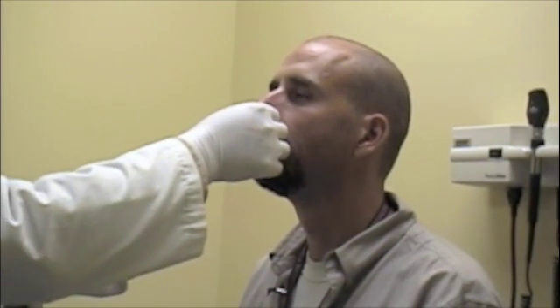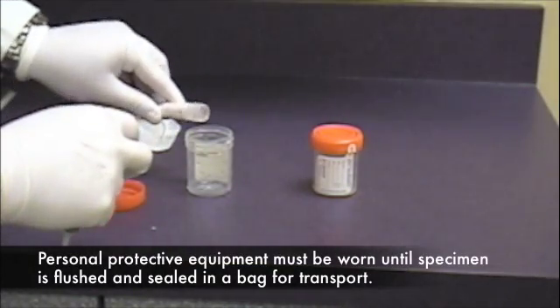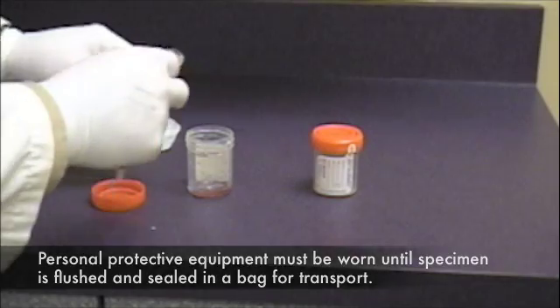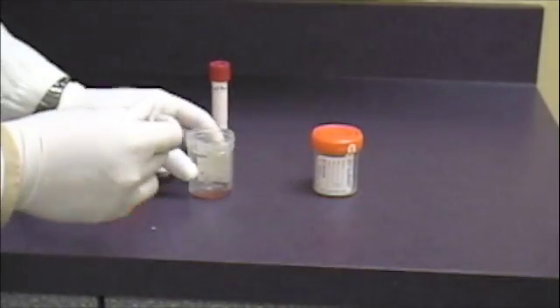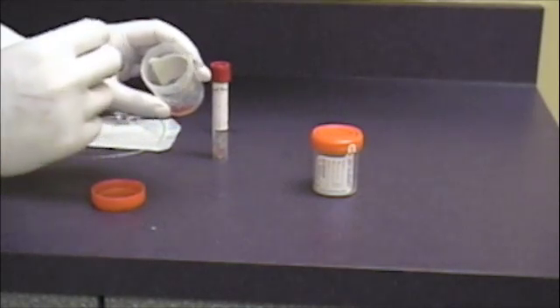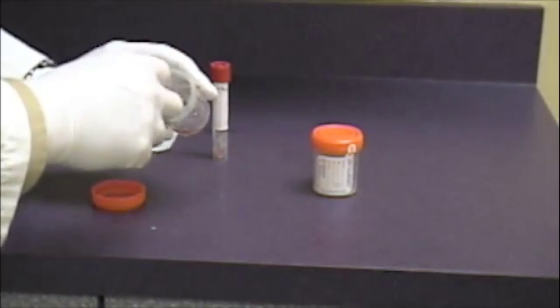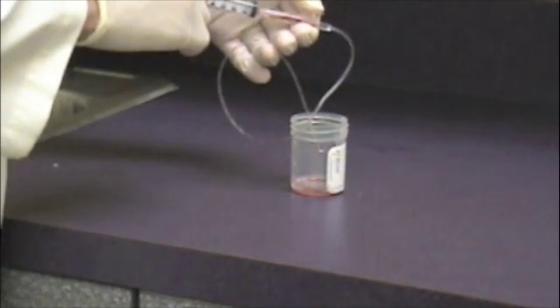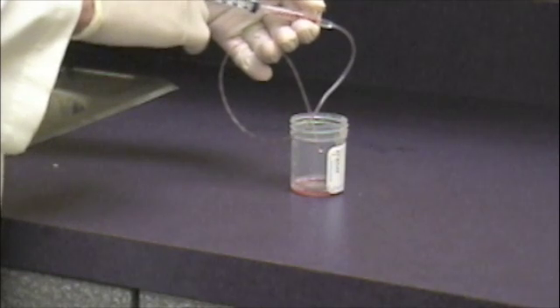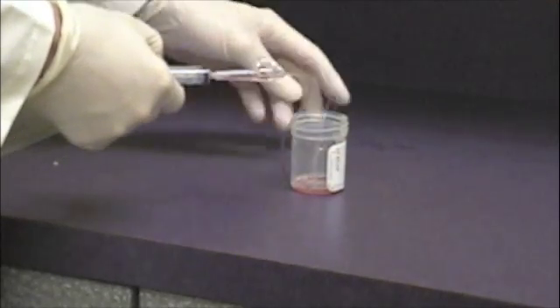Manually occlude the tubing as you aspirate. To prepare your sample for transport, empty a tube of new viral transport medium into a sterile container. Using the syringe you have used for aspiration, draw up one milliliter of this solution. Use the transport medium to flush the tubing, ensuring that you are occluding the opening. Cut the tubing and seal the vial in preparation for transport.